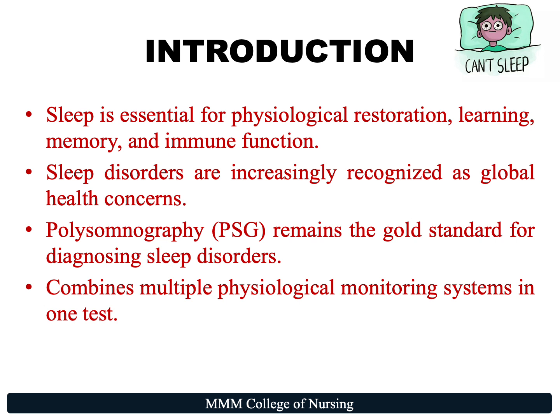Sleep is essential for physiological restoration, learning, memory, and immune function. Sleep disorders are increasingly recognized as global health concerns. Polysomnography, PSG, remains the gold standard for diagnosing sleep disorders. This combines multiple physiological monitoring systems in one test.